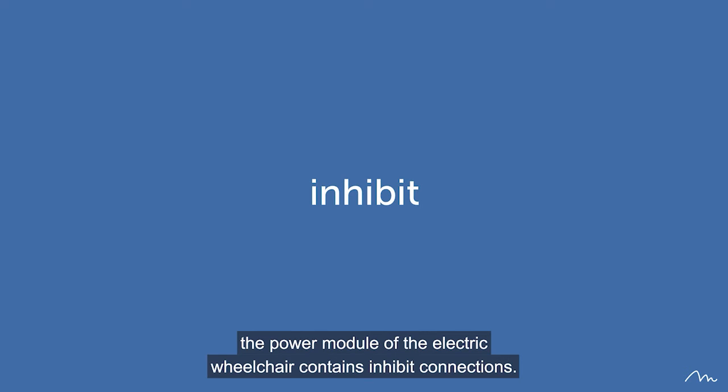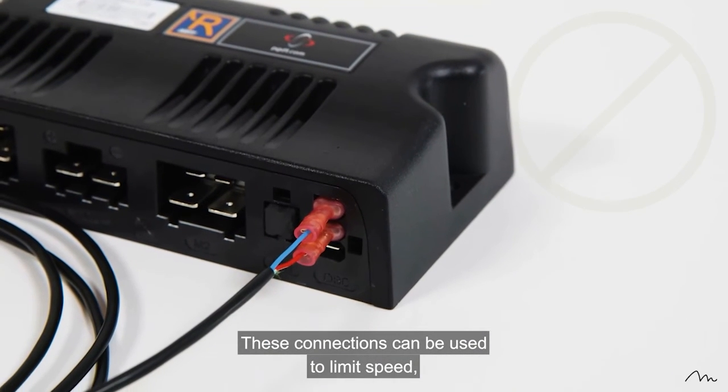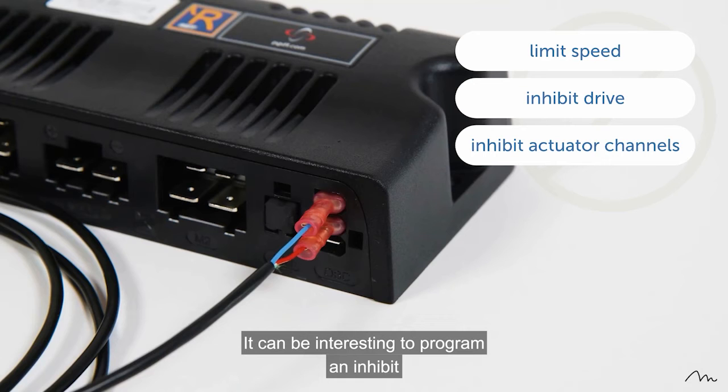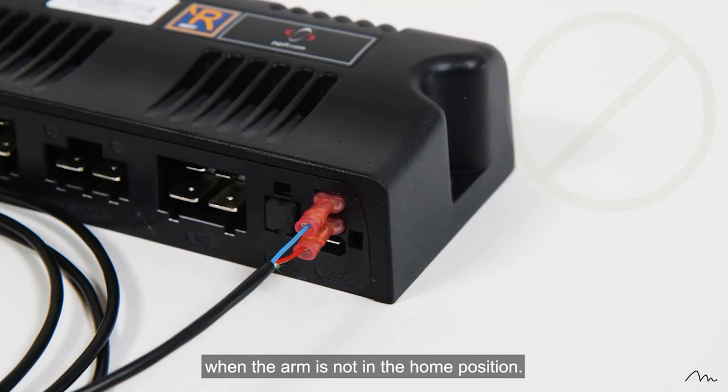In general, the power module of the electric wheelchair contains Inhibit connections. These connections can be used to limit speed, inhibit drive, or inhibit actuator channels. It can be interesting to program an Inhibit when the arm is not in the home position.